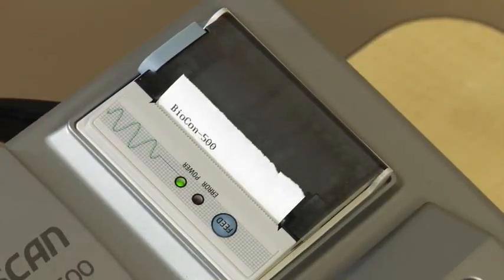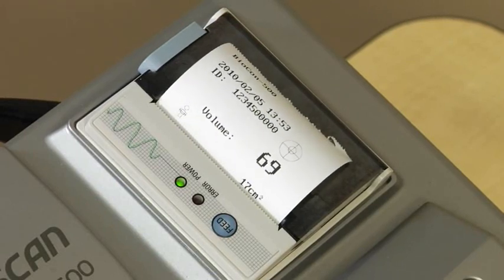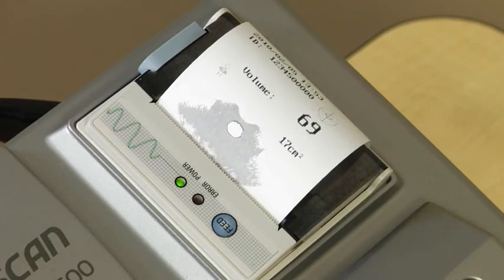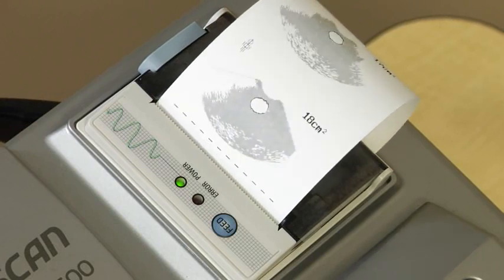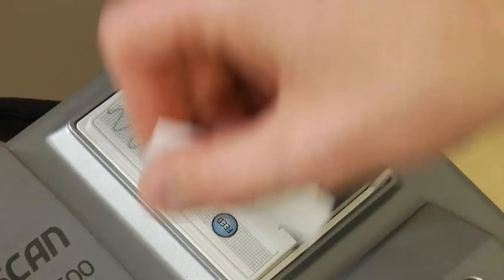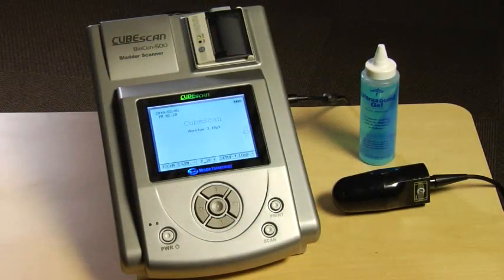Results can be printed on the built-in printer for documentation in the chart. Or, you can connect the scanner to a computer with a USB cable and easily transfer the data for viewing, printing, and storing results. Other companies may charge extra for the ability to access the digital data, but it's included free with the Biocon 500.